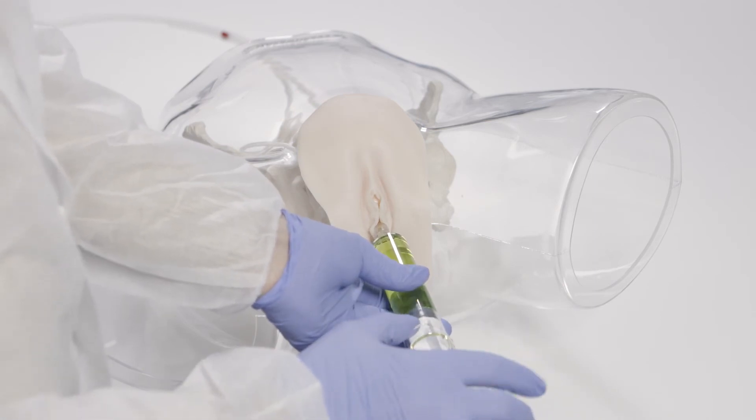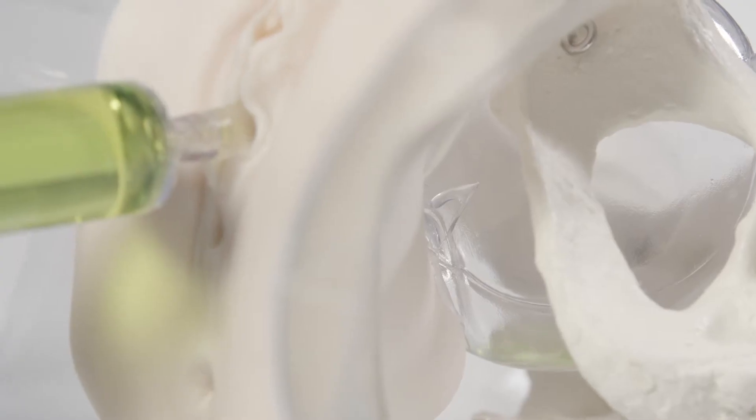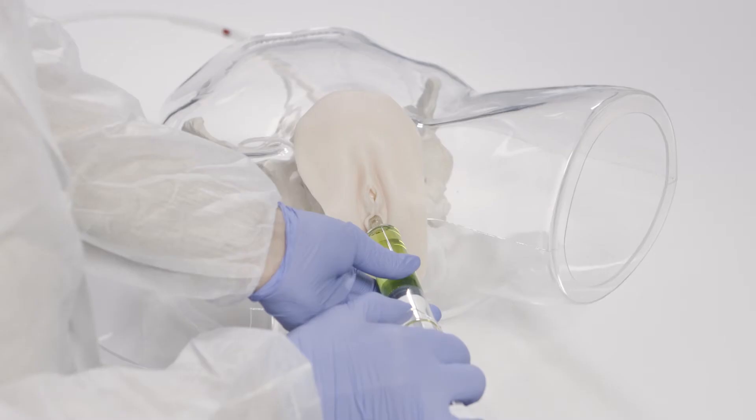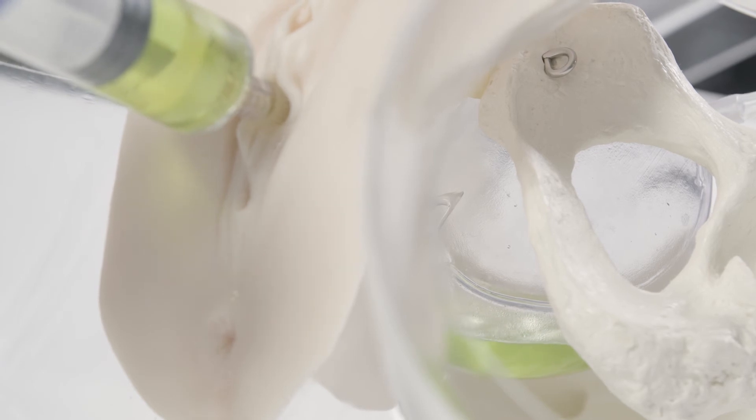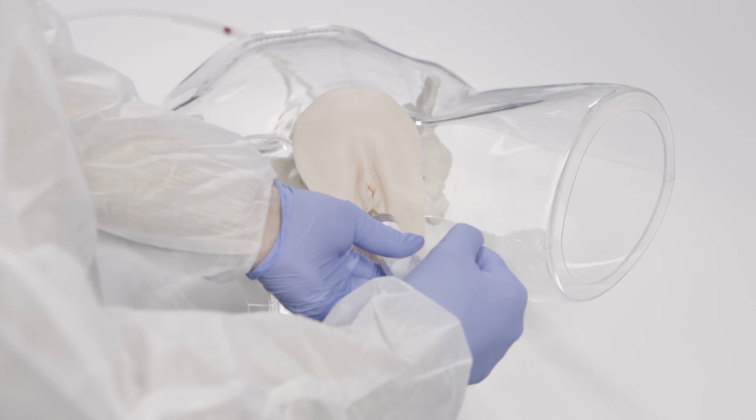I start the installation filling the bladder with 50 ml glycosaminoglycan solution. It is important to align the yellow adapter to the orifice to enable a direct flow into the urethral orifice straight and without resistance.